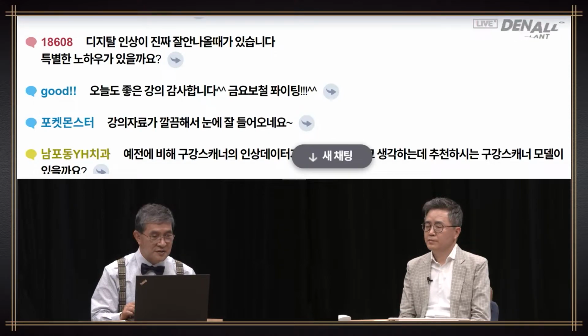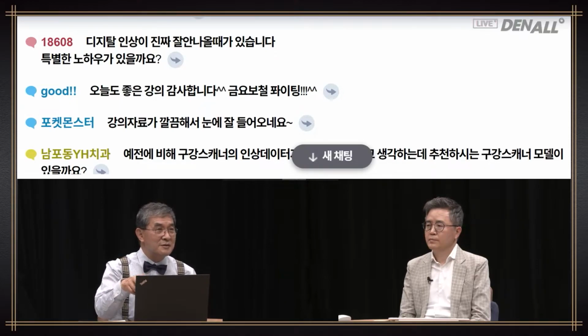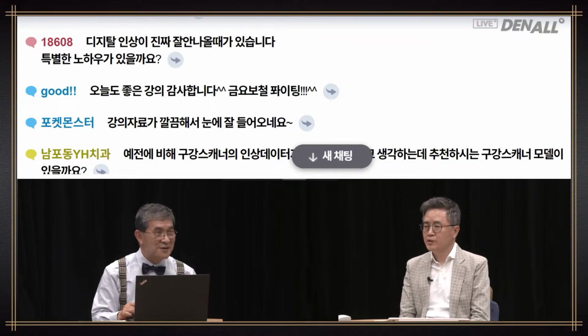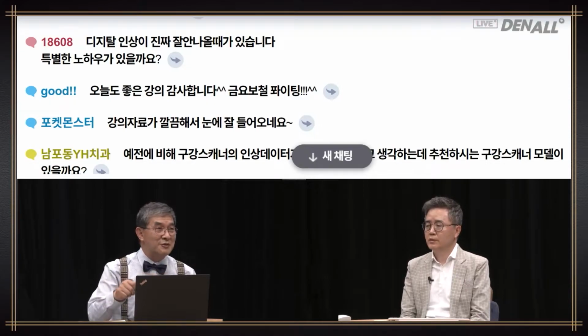Impression taking. Software may have a part in it, but depending on the dexterity of the person using the scanner, is it related? Definitely. It's the same with taking impression and scanning. It's related to the dexterity. You need to practice well.